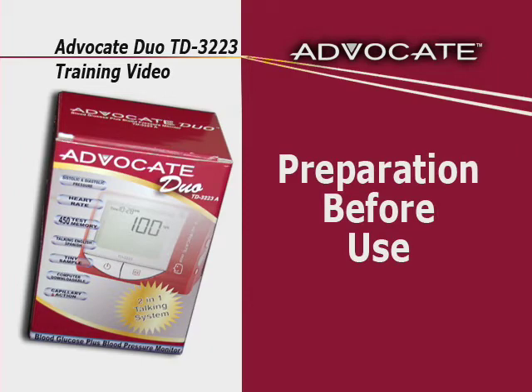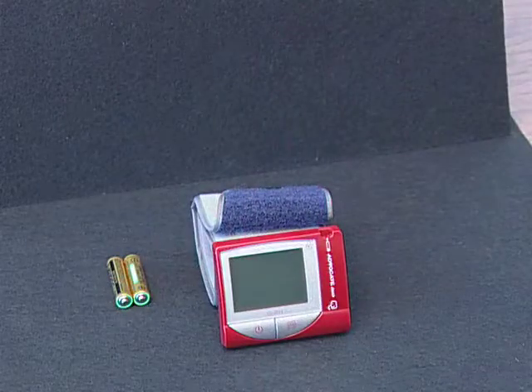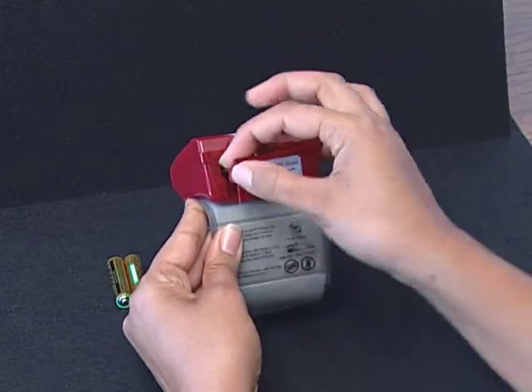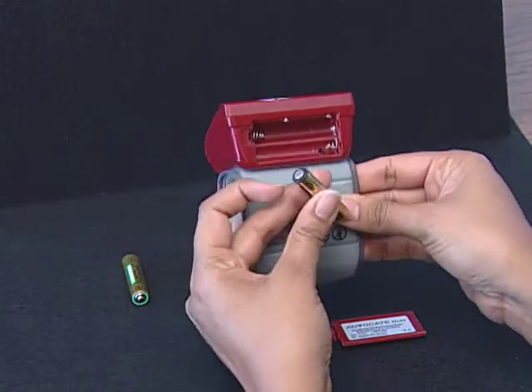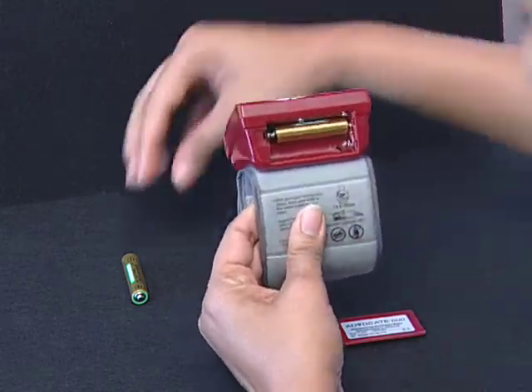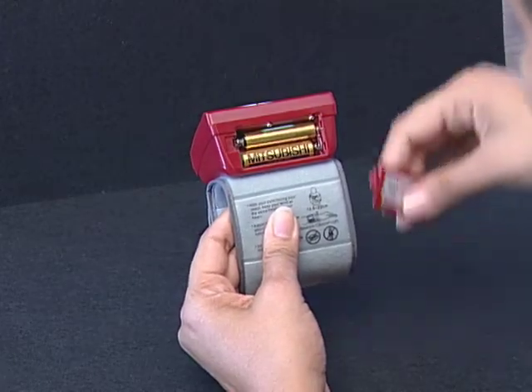Your meter comes with two 1.5 AAA-sized alkaline batteries. To install the batteries, make sure that the meter is turned off. Press the buckle on the battery cover and lift it up to remove the cover. Remove the old batteries and replace with two 1.5 AAA-sized alkaline batteries. If the batteries are inserted correctly, you will hear a beep. Close the battery cover.